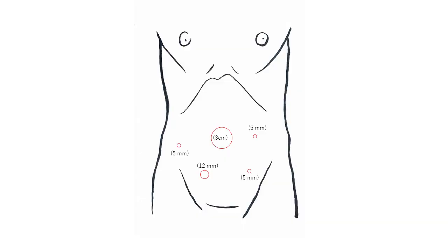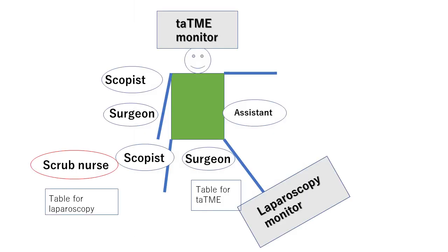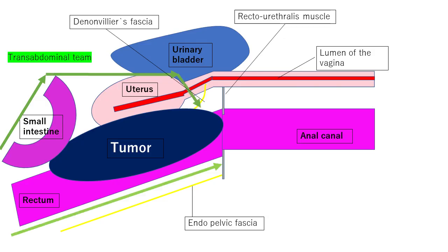A 3-centimeter incision was made at the umbilicus and an EZ axis was placed. An additional 12-millimeter trocar was inserted into the left quadrant, and three 5-millimeter trocars were also inserted. The transanal approach was simultaneously started by the transabdominal team. We planned to perform a rendezvous procedure on the Denonvilliers fascia.